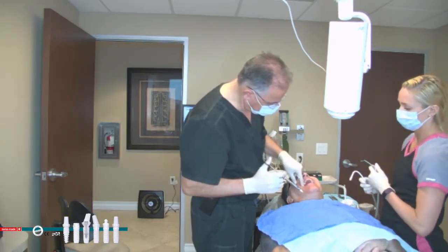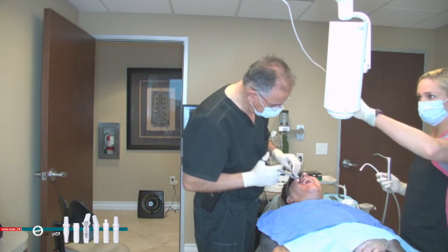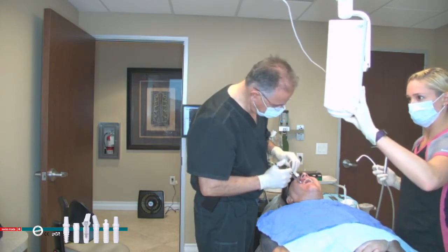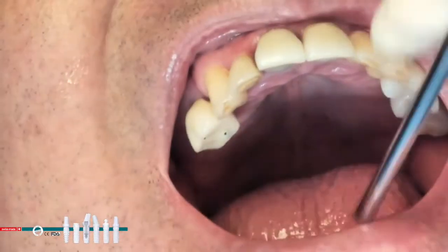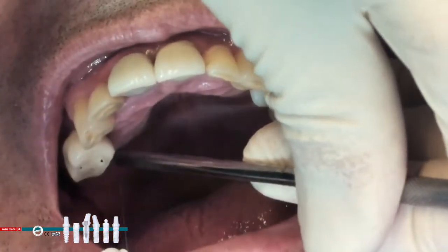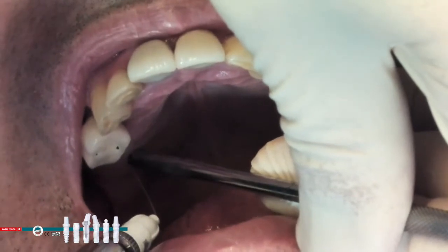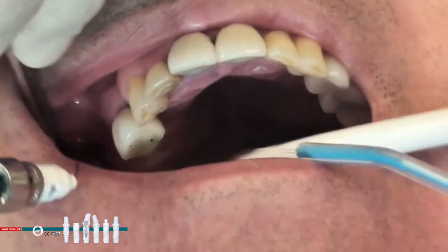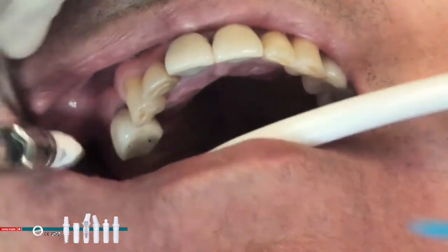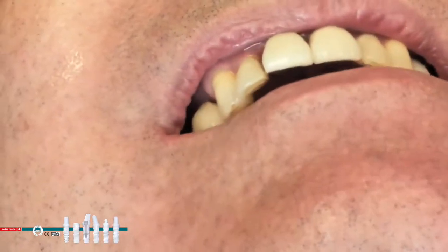I'm going to give you a little pinch here. Great, you're doing great. How you doing there? Just tilt it down just a tad. Perfect. Just a tad more. Okay. Perfect. Go ahead and open big. So we're going to place a little anesthetic on the palatal. Turn towards me, please, Mark. A little pinch right here. This is a tough one. Just hang in there. Doing great. And go ahead and close down. Great. How are you doing, Mark? Great. We're going to give that just a minute to kind of soak in, okay?